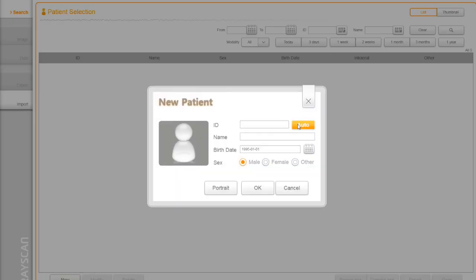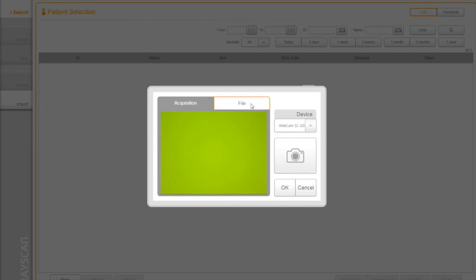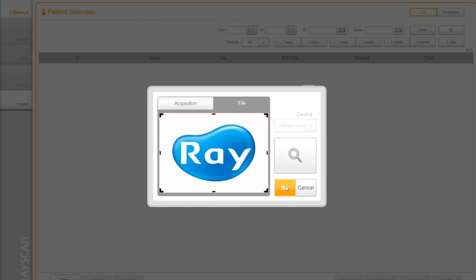To register a new patient, click on new button. You can also take a patient's picture or browse a file during the process.